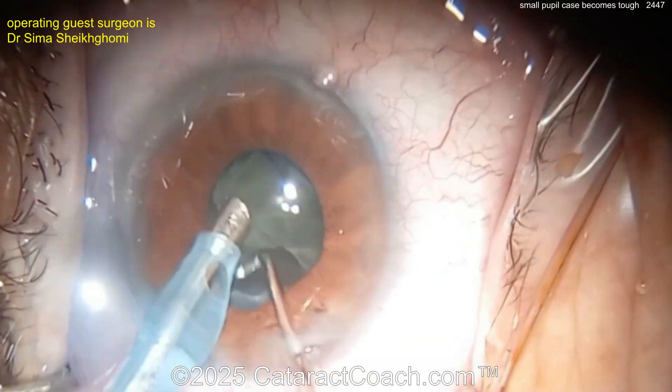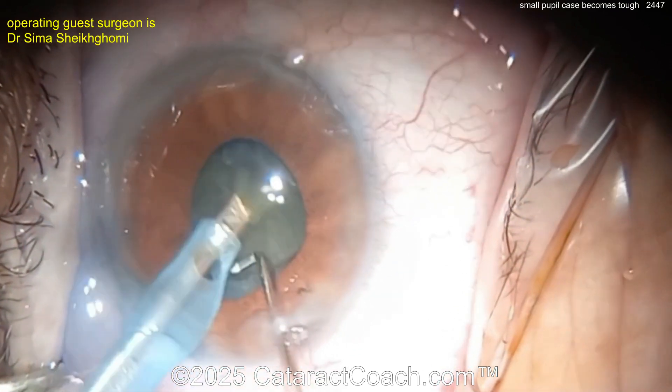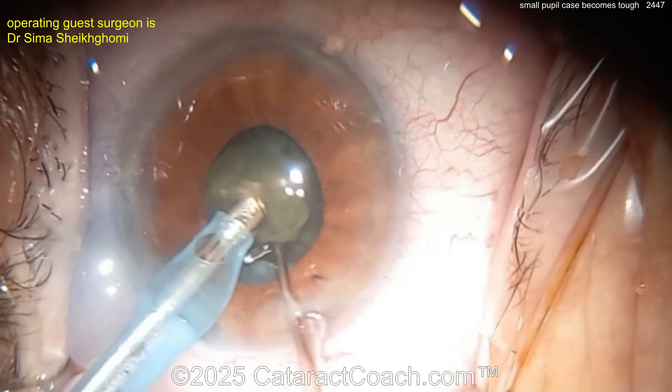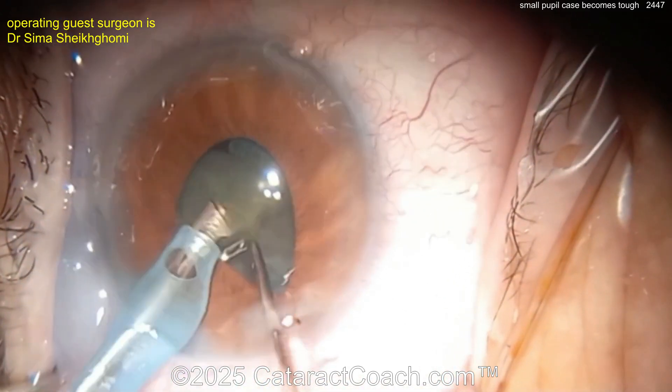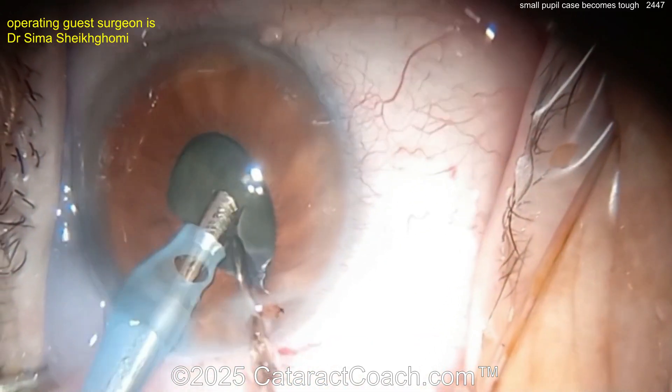This is definitely a Flomax-type case — floppy iris syndrome, IFIS — whatever you want to call it. The phaco probe looks good, taking out nuclear pieces with good chop technique. But look at the iris — it's prolapsing through the paracentesis.